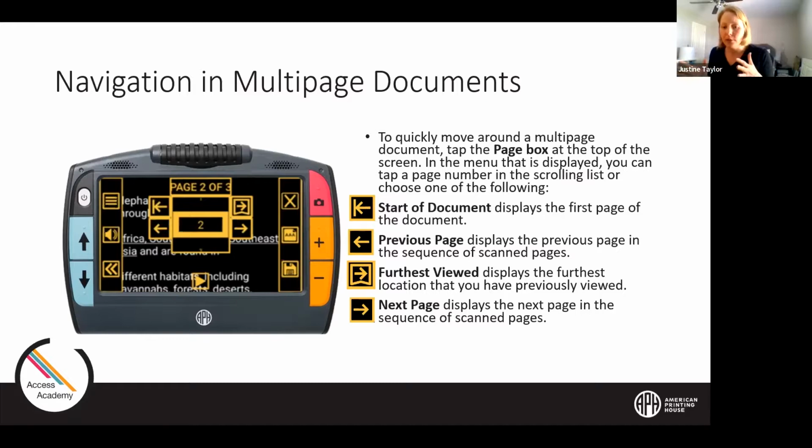You can maneuver the Juno so you don't have to maneuver your object or your text as much, which is really nice. And when you hit recognize text, it's going to process that OCR and automatically orient it in the right direction, which is really nice, I find. And it's pretty fast at recognizing that text as well, which is nice.